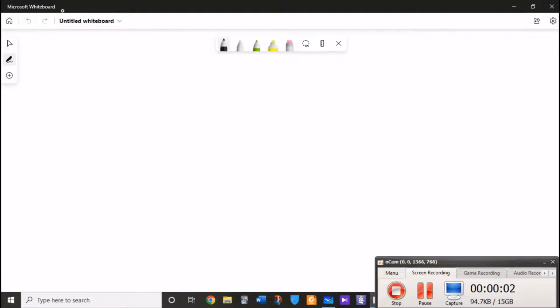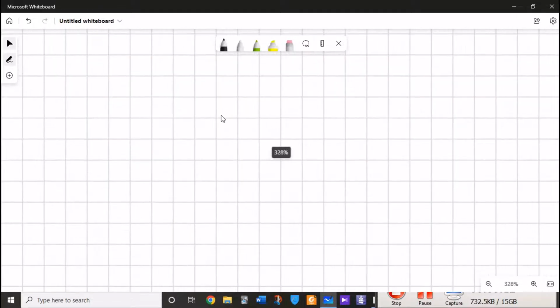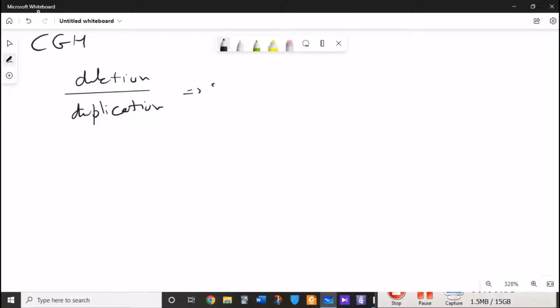Hello, in this video I want to teach the Comparative Genomic Hybridization technique, CGH. Comparative Genomic Hybridization is a very useful technique to detect deletions and duplications in solid tumors.